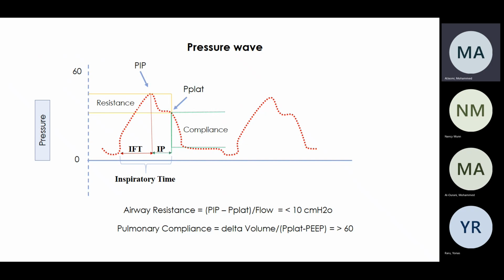And how do you calculate the static compliance? Good. So what PEEP are you talking about? That's right. You need to make sure that the PEEP I'm giving the patient is what the patient is actually having right now, or whether there is a big difference. If it's a 2 to 3 difference between the set PEEP and the real PEEP, there's no big difference. If there's real auto-PEEP, that makes a difference in your calculation, is that right?